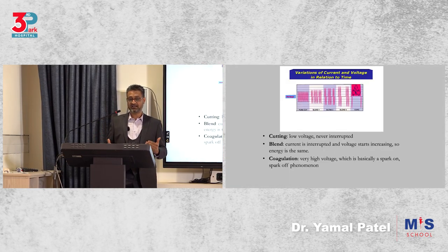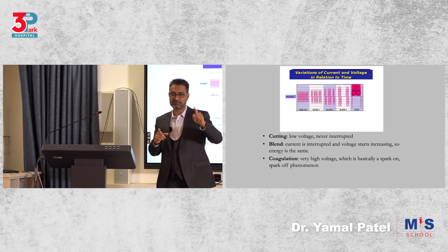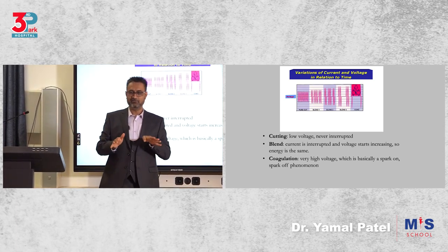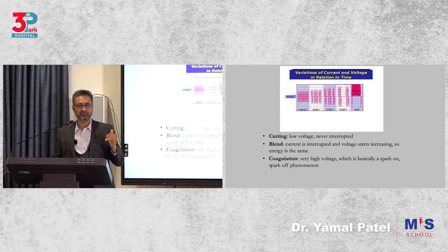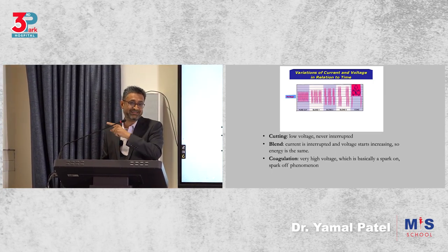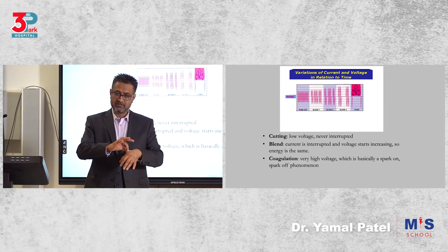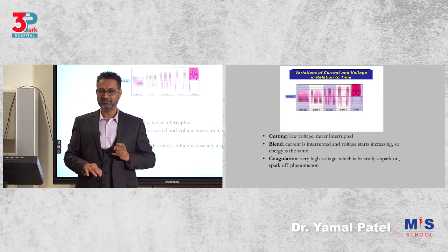So we should know about cut, blend, and coag. The mode. Please don't equate cut mode, or yellow, for cutting, and coag mode, or blue, for coagulation. Wrong. Okay? You use the cut mode because it's a lower voltage mode, and therefore it is a safer mode. The coag mode is very, very, very dangerous if you don't know how to use it. So even in open surgery, when you're cutting and then you hold a vessel and you want to buzz it, you don't buzz it with the blue, you buzz it with the yellow.